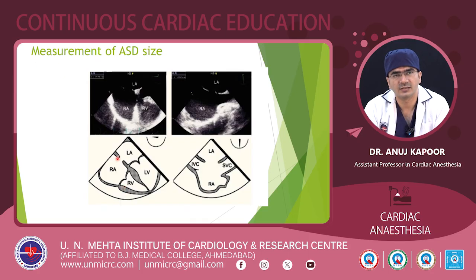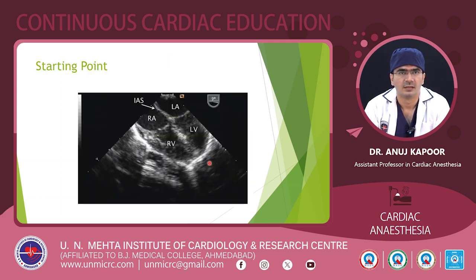So we will take the mid-esophageal 4-chamber at 0 degree. We will measure the defect size, and that would be the transverse diameter of the defect, and then we will rotate the angle to 90 degree, and here we can get the longitudinal size of the ASD defect. Further, the mid-esophageal 4-chamber view represents a starting point in the evaluation of the ASD, as it adequately displays the atria, the ventricles, the ASD, and the size of the left atrium and left ventricle also.